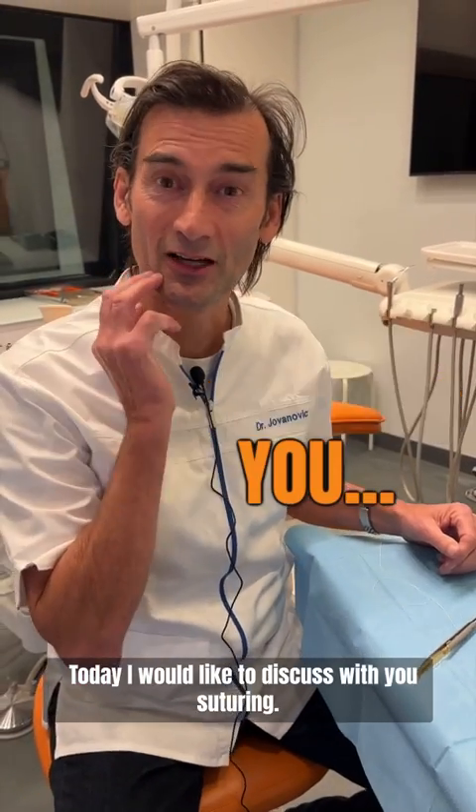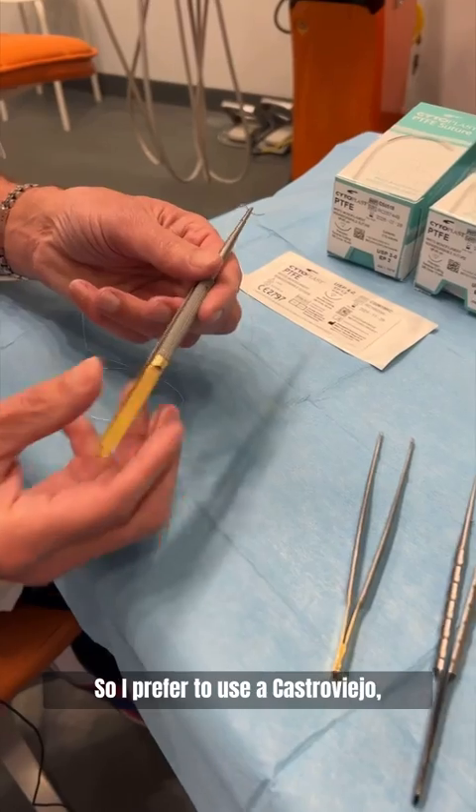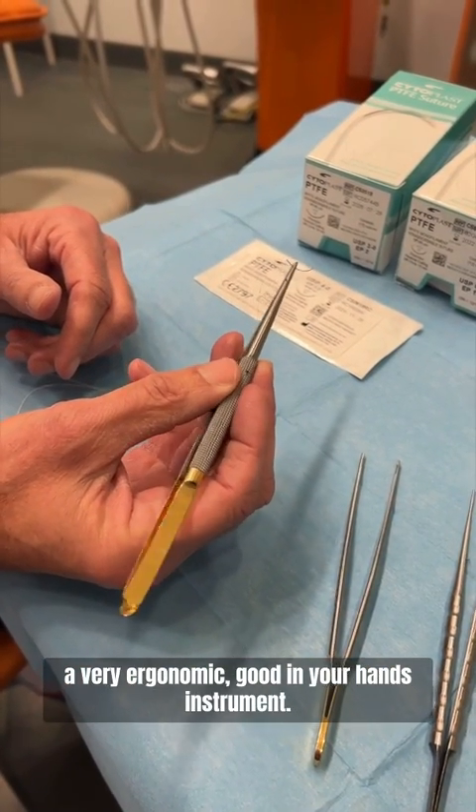Today I would like to discuss suturing. First I want to show the instruments. I prefer to use a Castroviejo — a very ergonomic, good-in-your-hands instrument.